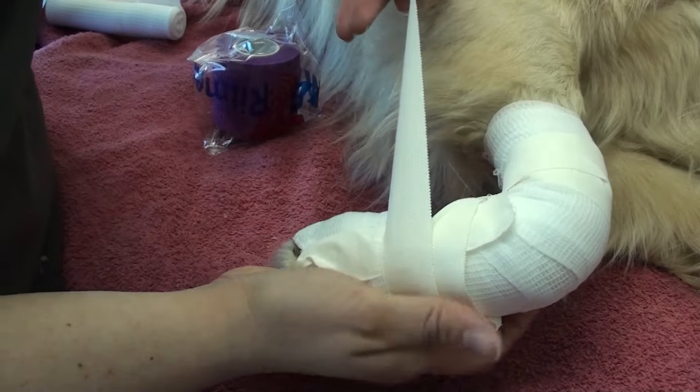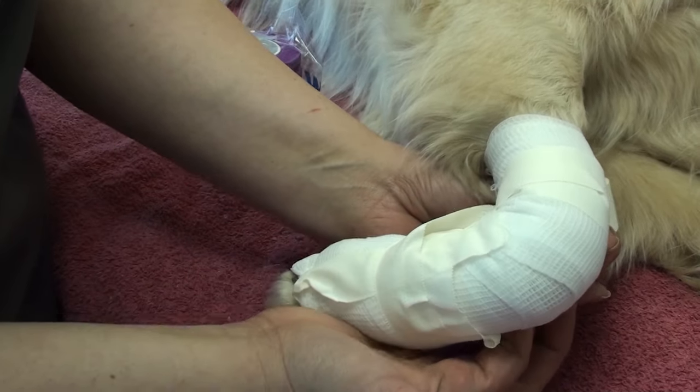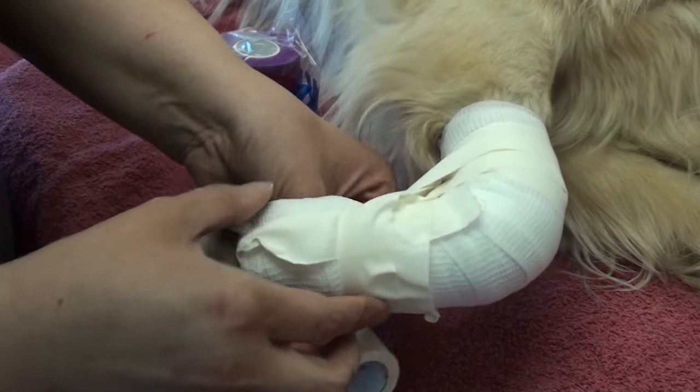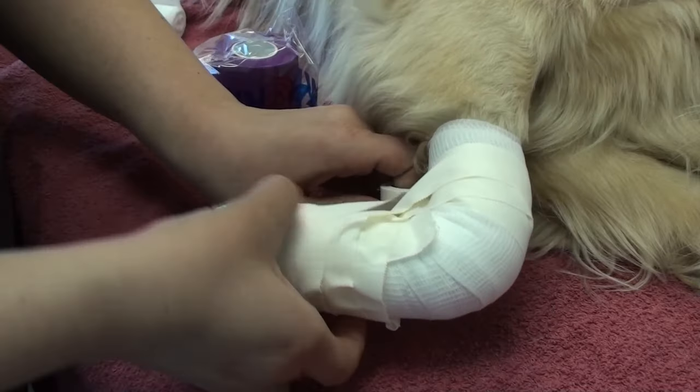So she's going a little further distal on the metacarpals and a little further proximal along the radius, always doing her figure 8 with a small twist in the tape.